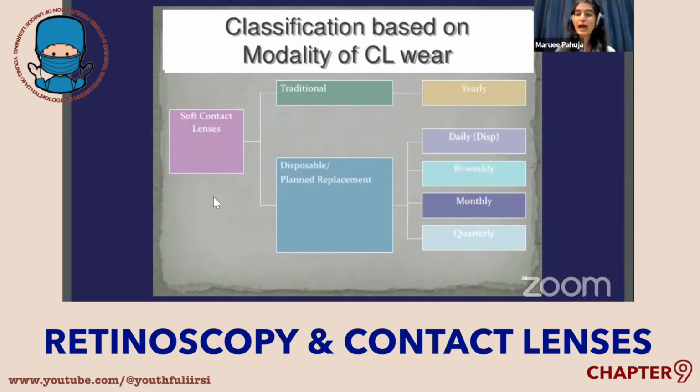Silicone hydrogel lenses provide high oxygen permeability, and therefore can also be worn as an extended wear lens. We do not really advise that in our country specifically because we do not know the compliance, but they can be worn longer during the day. So if I would give a hydrogel lens for 10 hours, I would tell the patient that you can wear a silicone hydrogel lens throughout your waking hours, be it 14, 16, or 18 hours. It's not a problem at all because they provide high oxygen permeability and are definitely way more comfortable, because you will avoid the dryness issues that can happen by the end of the day, and the fatigue that can happen with soft contact lenses if worn over a really long period of time.